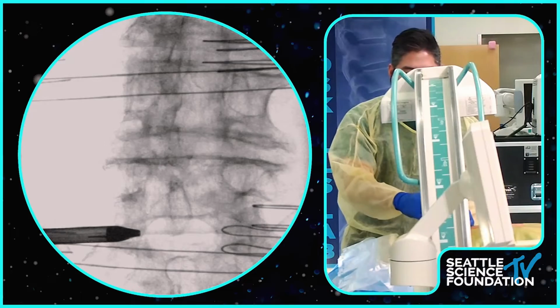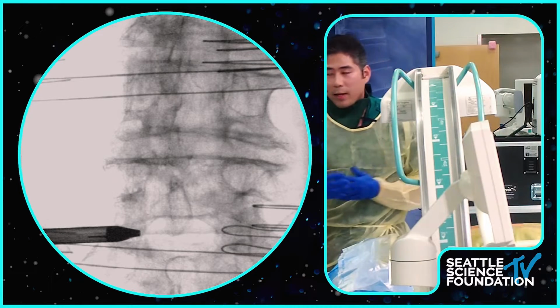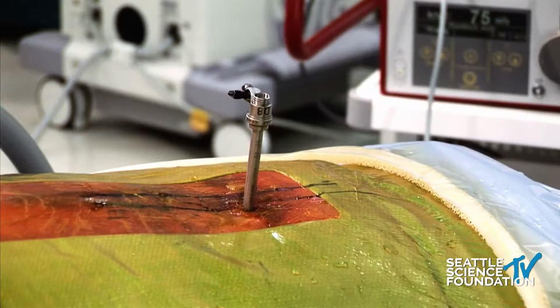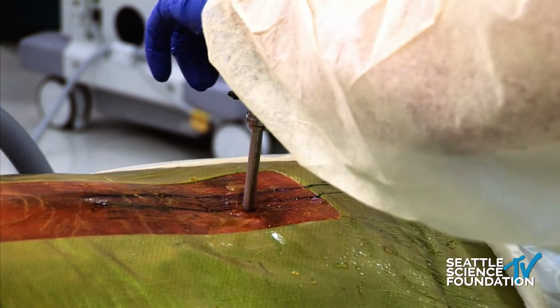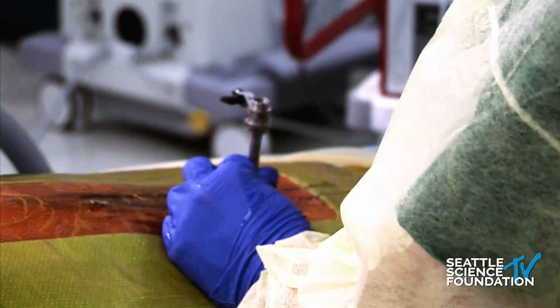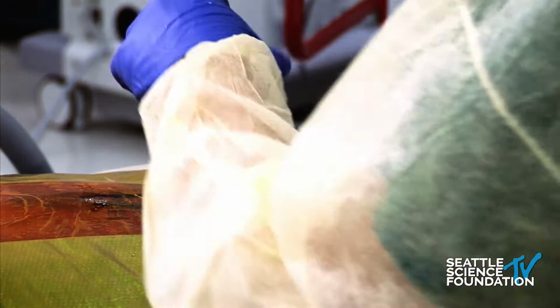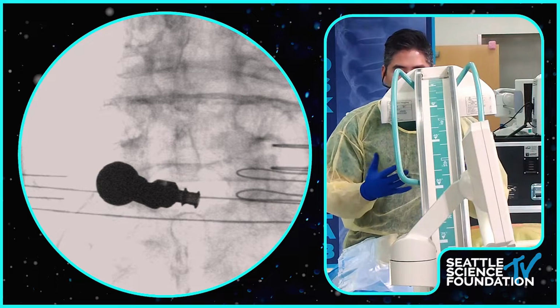If you don't have a cutter like that, I'll take the pituitary then. Take a shot here. I just want to make sure that that is pointing towards... So I always put the tip of this instrument pointing in the same direction as my opening. This is a bevel tube, so I know, without looking at it, which way the bevel is opening up.